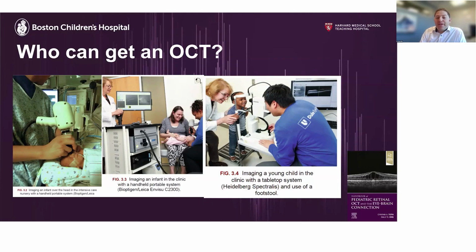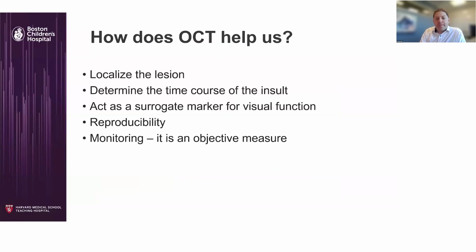I always like to point out that OCT macula scans are the fastest scans, so they generally help in that sense because they just go the quickest. And then you can see a lot of utility in the ganglion cell layer, which we'll talk about in depth. And this was the Heidelberg Spectralis OCT machine. I know there are a lot of them. That's pretty much the major machine that I'm going to be talking about today, as it's what we use here.